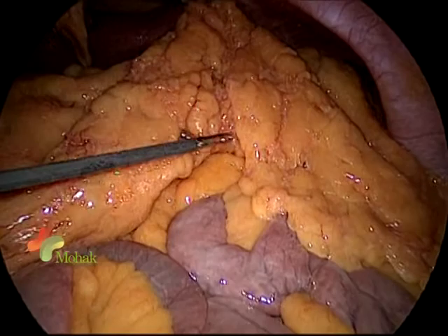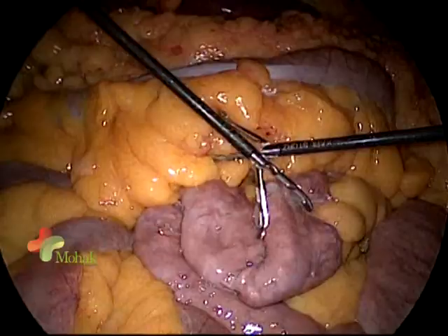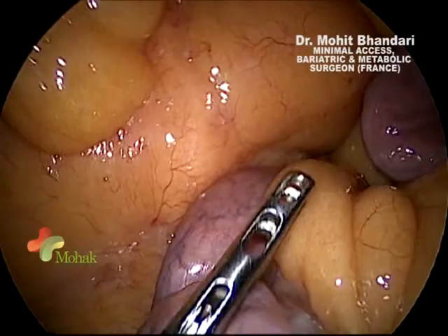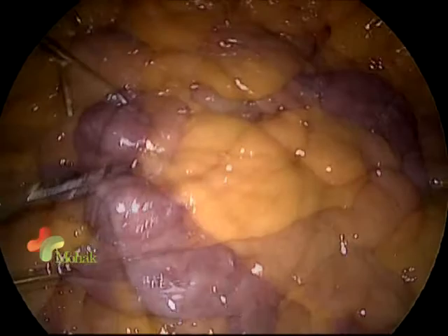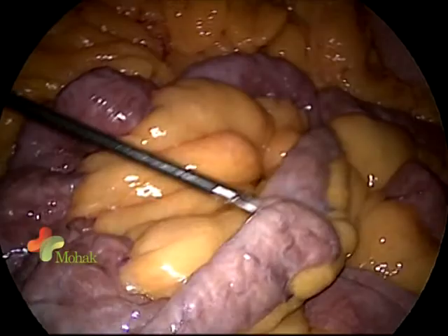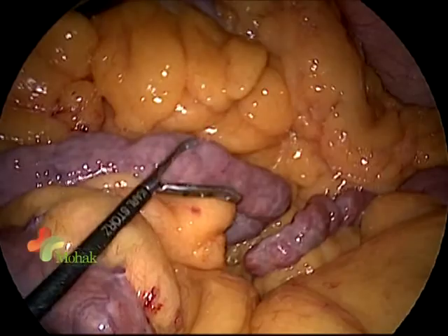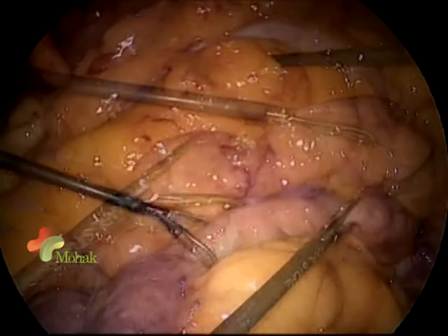We present a case of laparoscopic gastric bypass using a conventional approach. An important first step is to perform diagnostic laparoscopy and park the thick omentum just below the edge of the liver so it does not come in the way. Park the omentum at the edge of the liver and you will be able to see the ligament of Treitz. Then form a C-loop with the jejunum to trace and count the bowel easily.